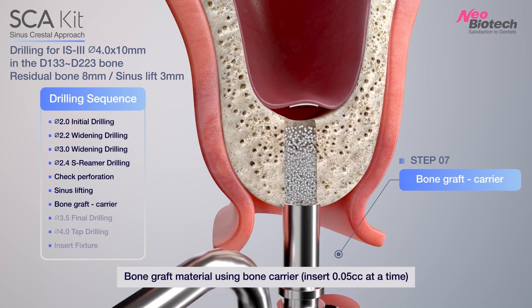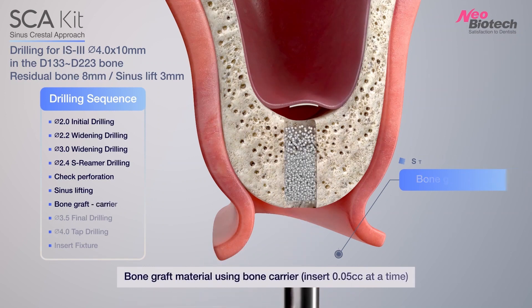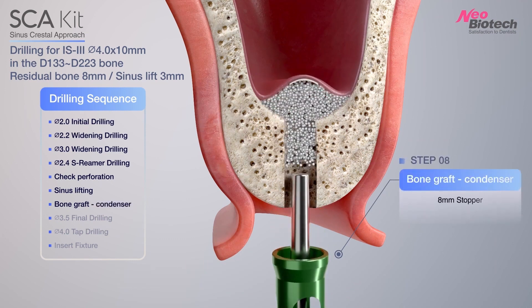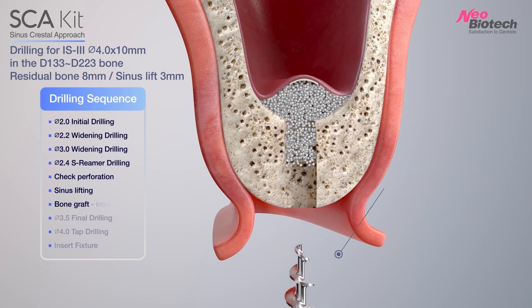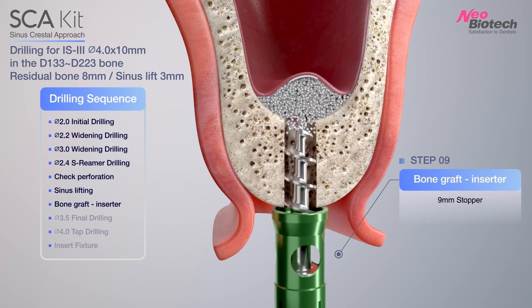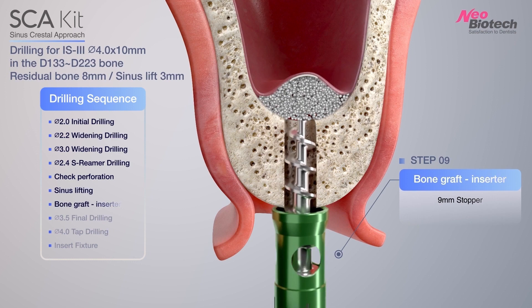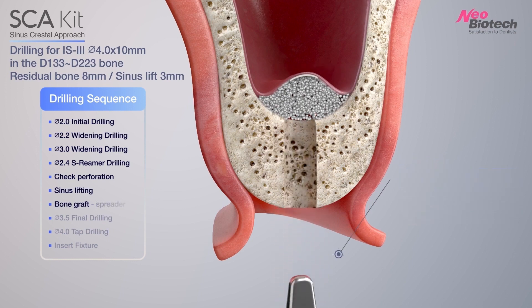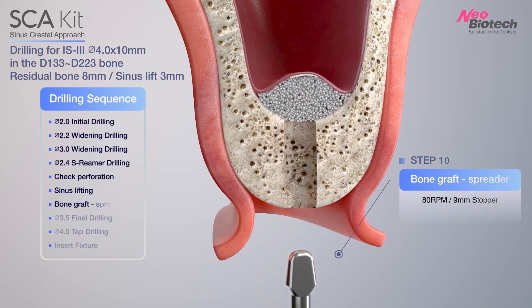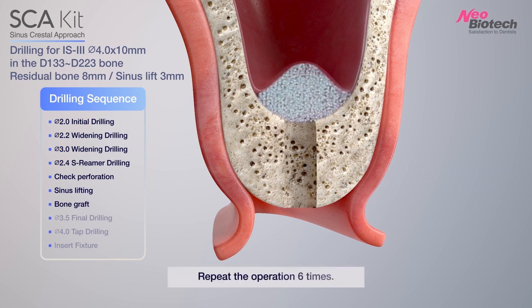Bone graft material is applied using a bone carrier. Insert 0.05cc at a time, then push the bone materials inside with a bone condenser. When the bone no longer goes in, you can insert the bone more easily by using the bone inserter. Spread out the accumulated bones with a bone spreader. Repeat this process 6 times for 3 mm membrane lifting.